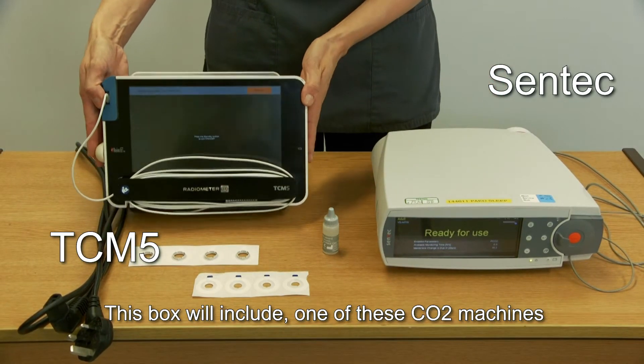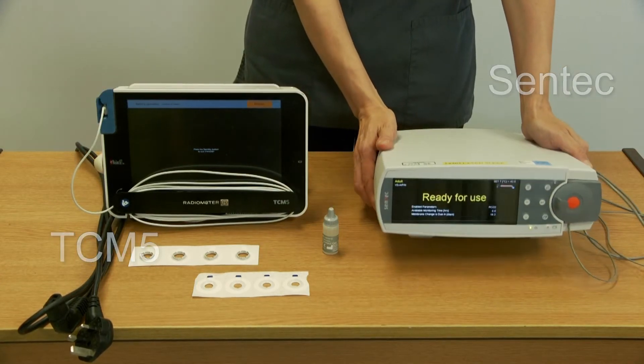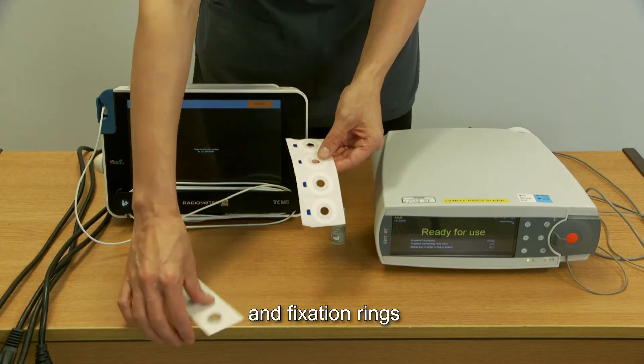This box will include one of these CO2 machines, a power lead, contact gel, and fixation rings.